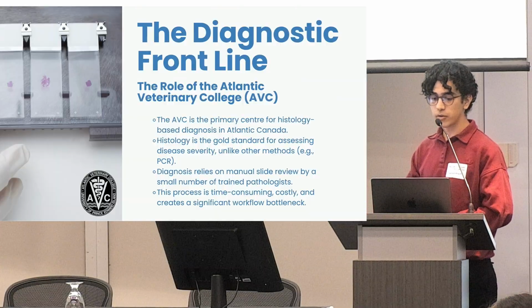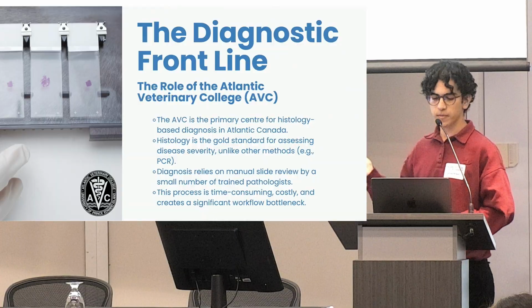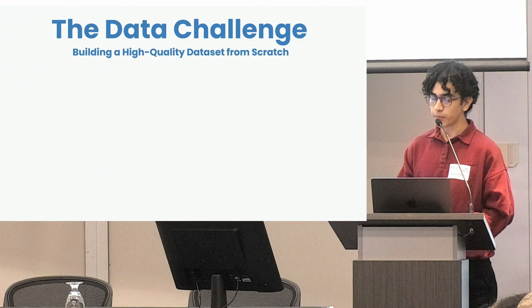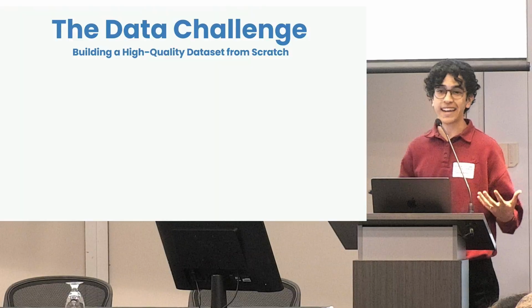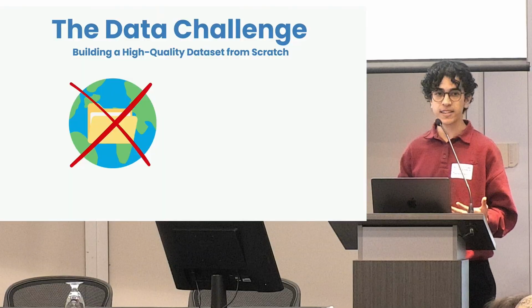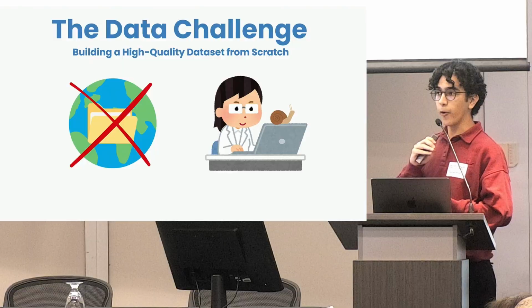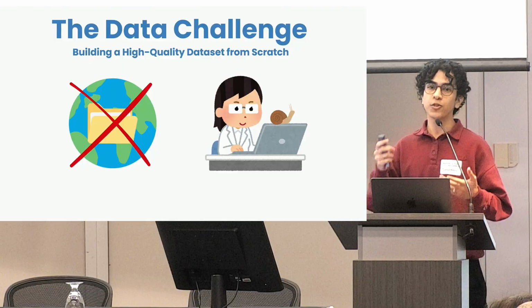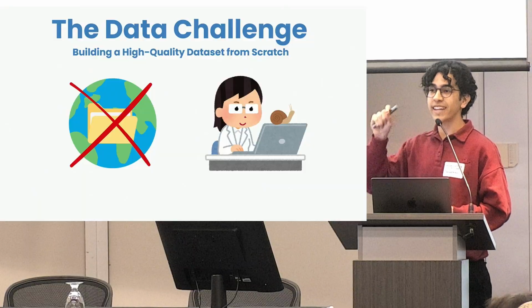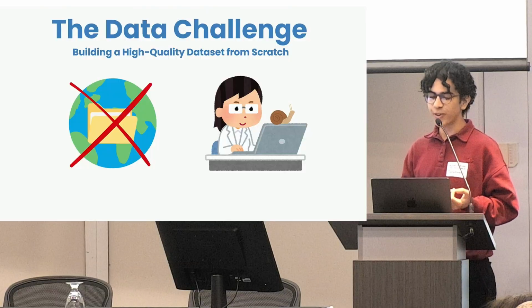So what we're trying to do is help him build a custom tool that can assist him in this process. And in any machine learning project, our first step is to analyze our data. However, we have no data. There's no publicly available MSX dataset, which means that we need to ask our pathologists, who are very busy, to spend countless hours analyzing these slides and outlining every single one of these parasites, which is kind of contradictory.